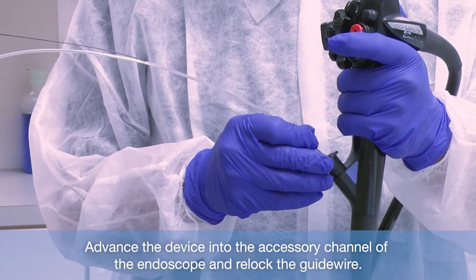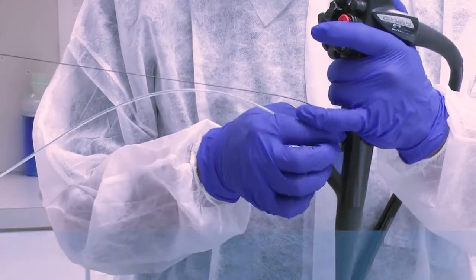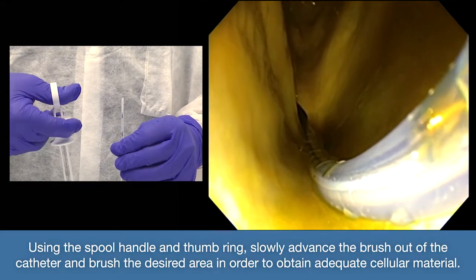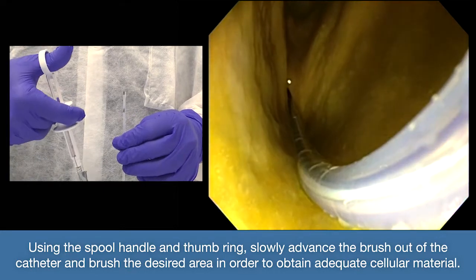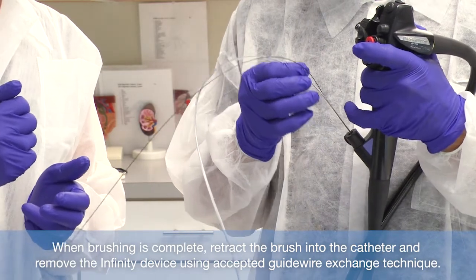Advance the device into the accessory channel of the endoscope and re-lock the guide wire. Using short strokes, continue to advance the device until the distal end of the sheath is endoscopically visualized. Using the spool handle and thumb ring, slowly advance the brush out of the catheter and brush the desired area in order to obtain adequate cellular material. Brushing the desired area will be easier with the endoscope elevator lowered. When brushing is complete, retract the brush into the catheter and remove the Infinity device using accepted guide wire exchange technique.